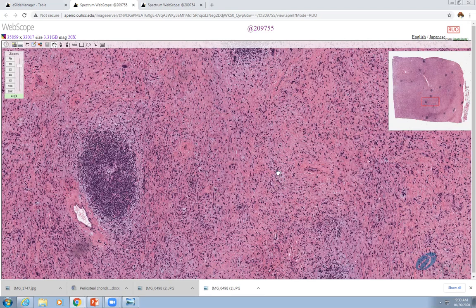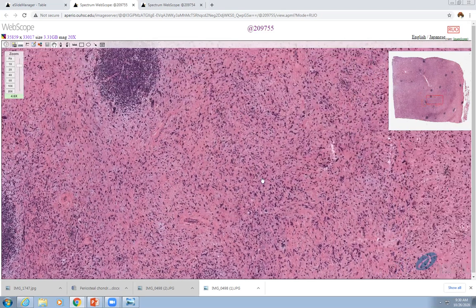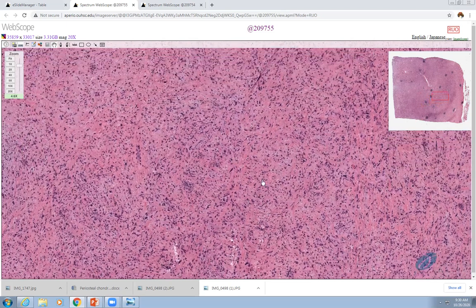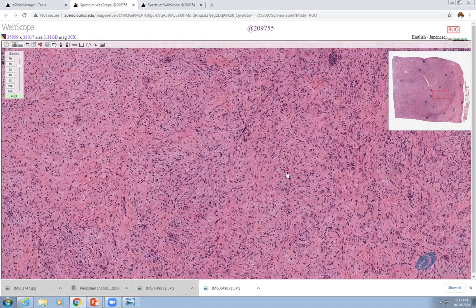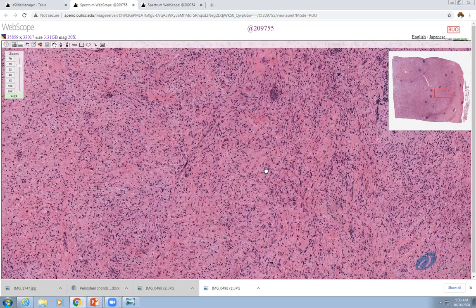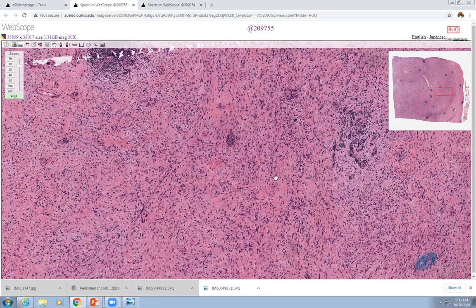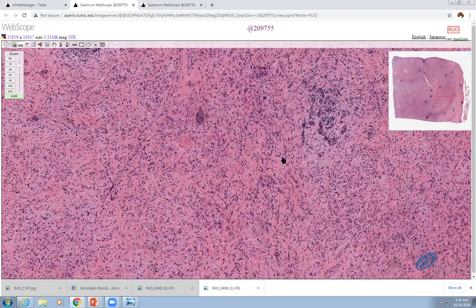We did some immunostains to rule out solitary fibrous tumor, leiomyosarcoma, and GI stromal tumors — those were all negative. Neural differentiation was not evident; S100 was negative. We did do a P16, which can be strongly positive — not by HPV involvement, but by mutation of that gene — and that was strongly positive in this tumor. Ultimately, after a few days' wait, MDM2 amplification was reported by our FISH laboratory.